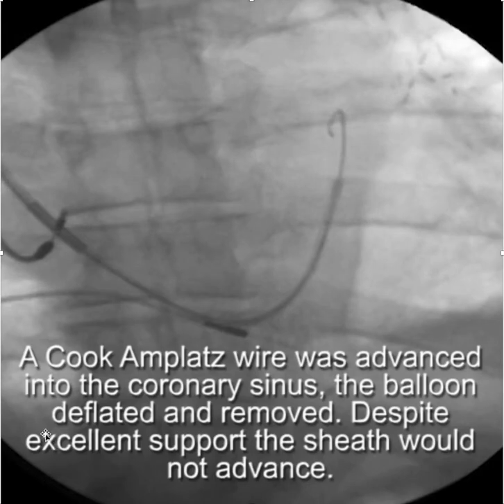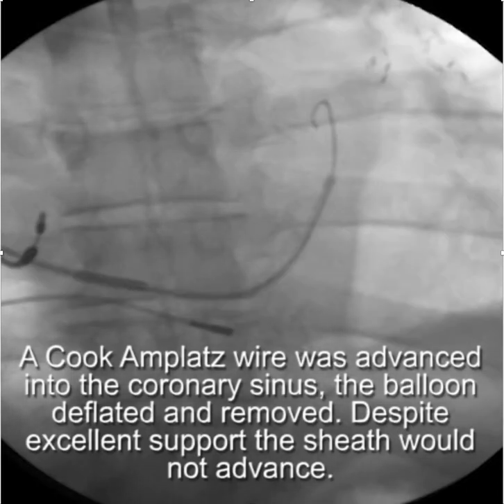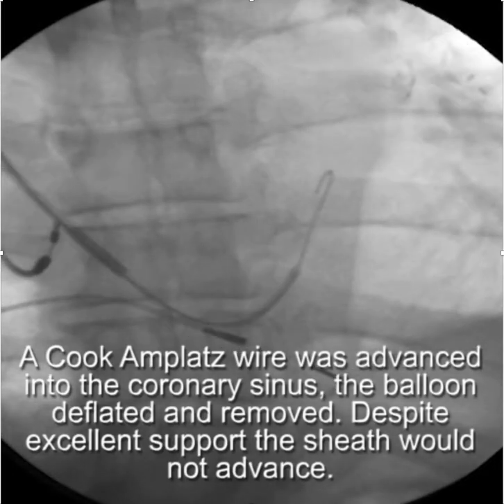I didn't think I needed the balloon anymore, so I deflated it after placing an Amplatz wire to stabilize the multi-purpose guide. However, trying to advance the sheath into the coronary sinus here — you can see that it's just not going to happen.